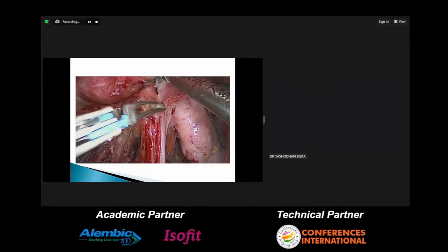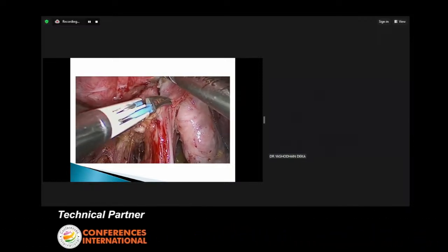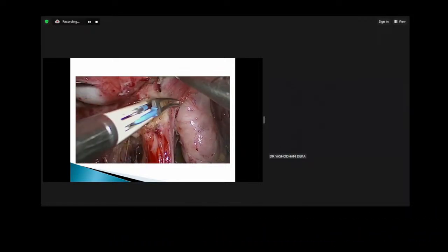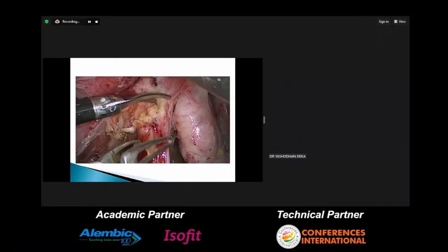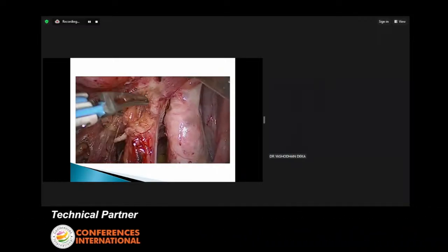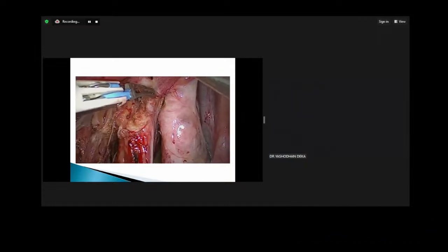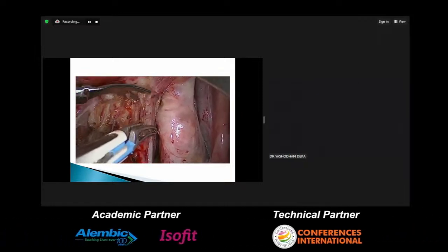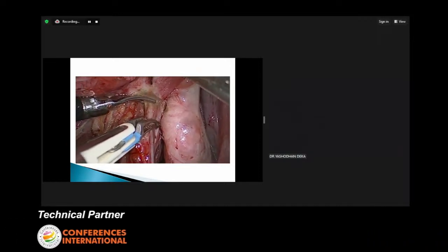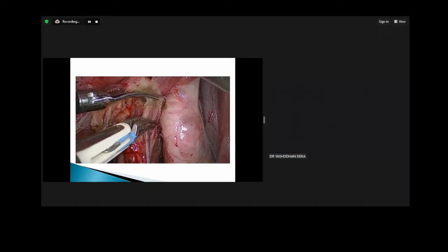And then we come to the part where we have to dissect the bladder and the bowel from the uterine torus. At this point of time, we like to switch over to simple bipolar and scissors for two reasons. The bipolar buzz keeps the field bloodless, and when you cut with the scissors, you can actually feel when the nodule is coming. And I feel that when you cut with a scissor, it's a much more clean cut, a cold cut. And even if you injure the bowel at this point of time, of course you can repair it without any problems.